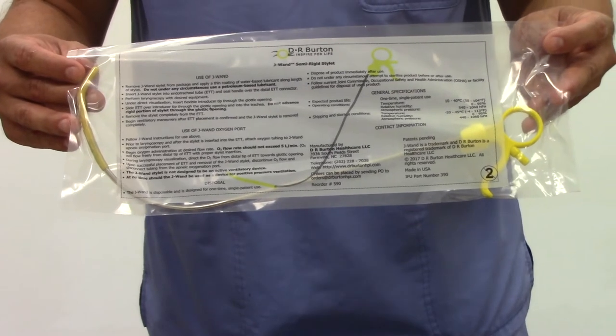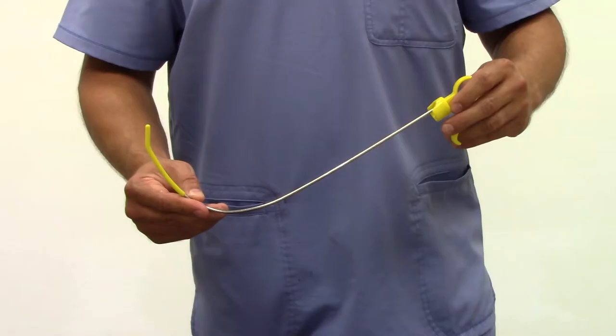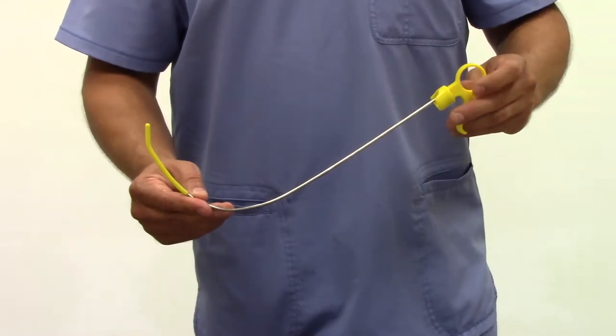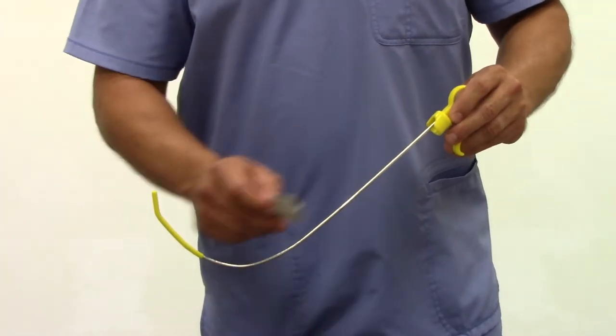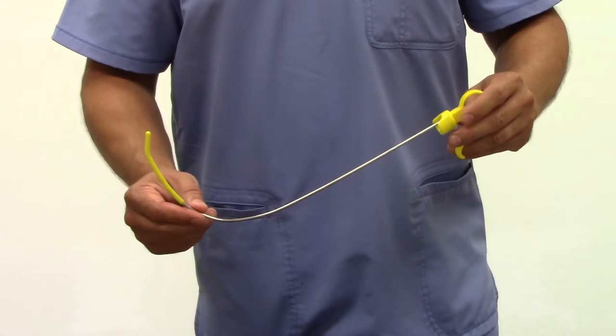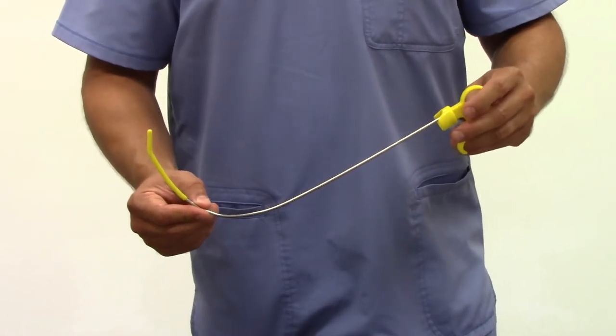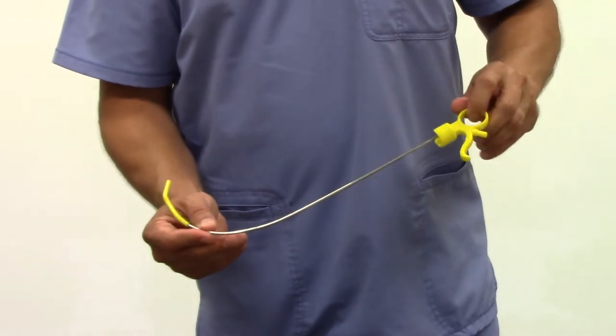Let's get started on how to use the J-WAND. Once the J-WAND is removed from its package, apply a thin coat of water-based lubricant to the stylet. Under no circumstances should a petroleum-based lubricant be used. At this point, we can also examine the features of the J-WAND.